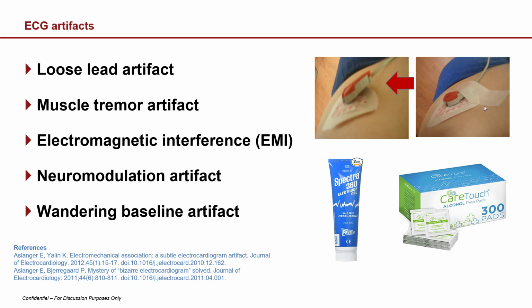Another thing to keep in mind is muscle tremor artifacts. If your patient's having shoulder pain and they start to twitch, your ECGs are going to capture that electronic motion, and that may impact when the exposure settings increase or decrease the exposure. You can also get electromagnetic interference. For example, a pacemaker might give you additional electrical information, and that could impact your ECG waveform as well.